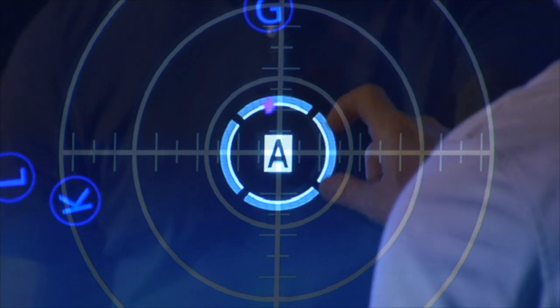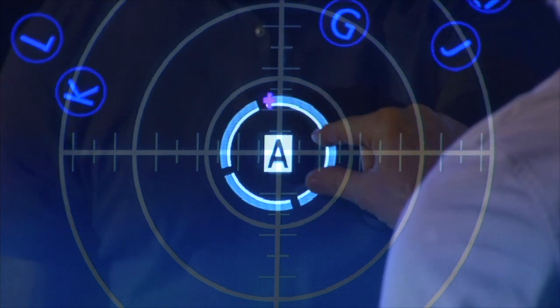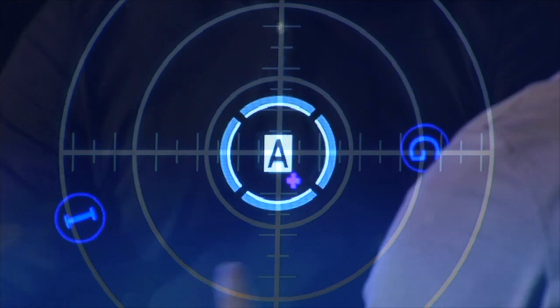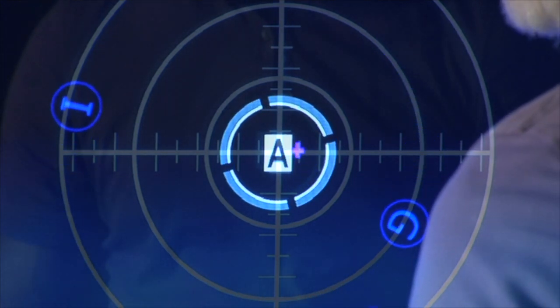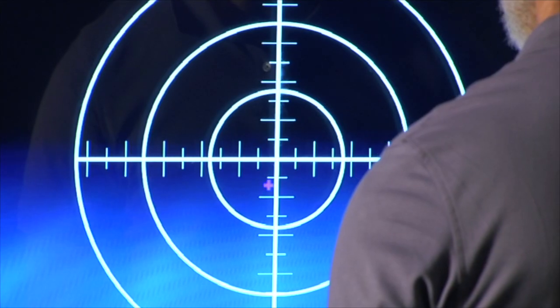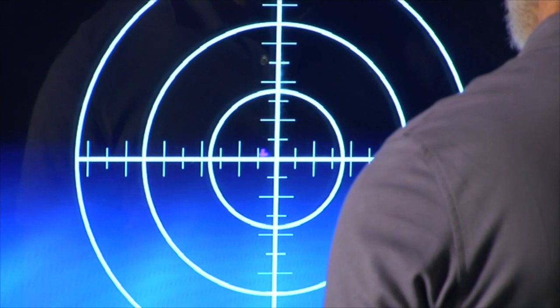And again, the precision with which I have to keep this centered is dependent on how large I made that bullseye before I began the procedure. This allows you to get biofeedback on balance and combine it with any program on the SVI.